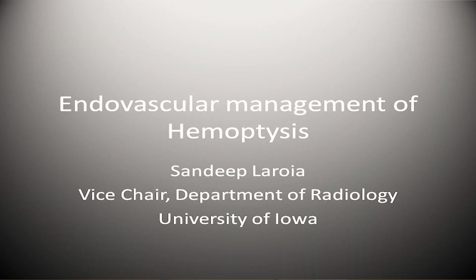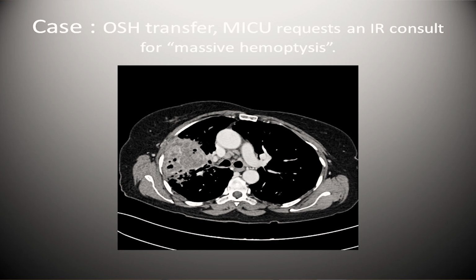So this topic is a very niche topic, hemoptysis, but we all come across hemoptysis cases quite frequently, so I thought we would talk about that. So let's start with this case. This elderly person came from an outside hospital, an OSH transfer, and then the MICU is requesting an IR consult, and as is typical, the consult text just says massive hemoptysis.